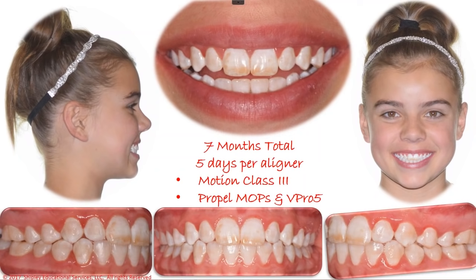So this is a way that we can take that class 3 Invisalign case, implement different strategies to be more efficient and finish it faster. We implemented several things. The motion class 3 to take her from the class 3 into a class 1 and even overcorrect it. We used the propel to help in the effectiveness of the motion class 3, and then we used the V-Pro 5 to help us seat the aligners better, and she got an absolutely fabulous result, a beautiful change in her profile, and now when she's a little later in adolescence and she does the aesthetics on the front, it'll be absolutely gorgeous.